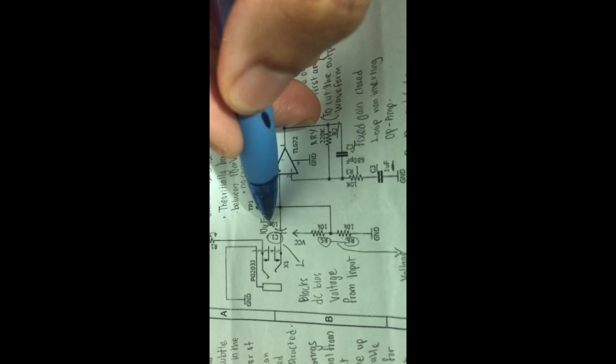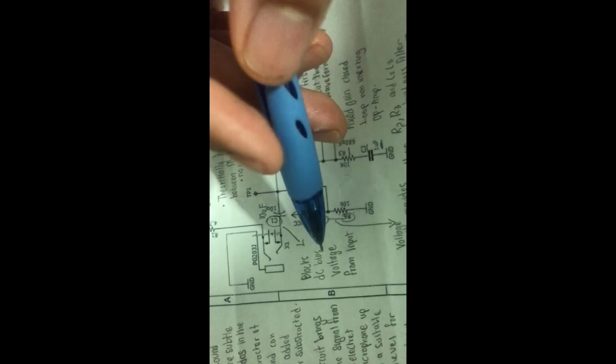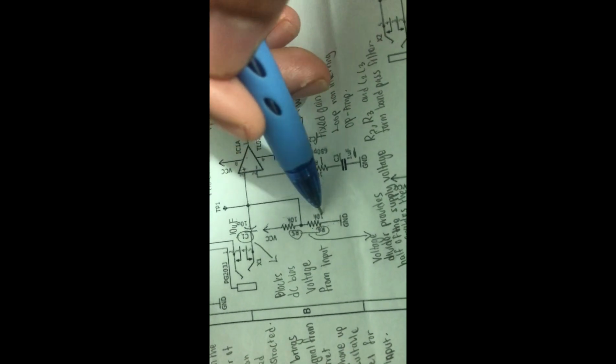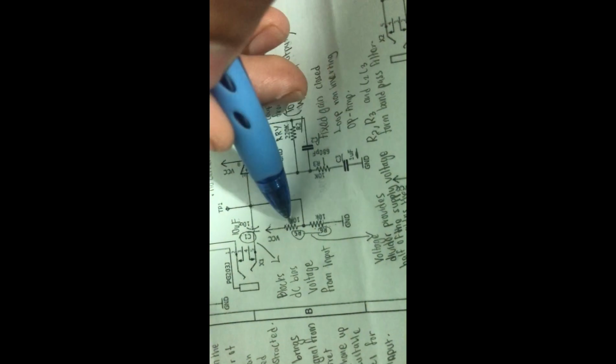C1 is a 10 microfarad capacitor, which blocks DC bias voltage from the input. As you can see, the circuit down here, which is made of two 10k resistors, R6 and R5, is a voltage divider circuit. This voltage divider provides half of the supply voltage, which enables the op-amp to work in single power supply mode at 4.5 volts.